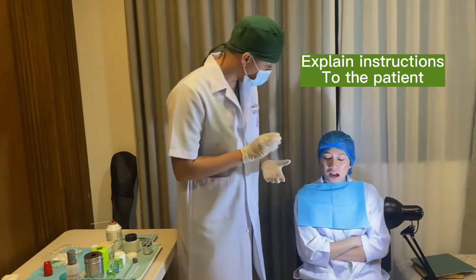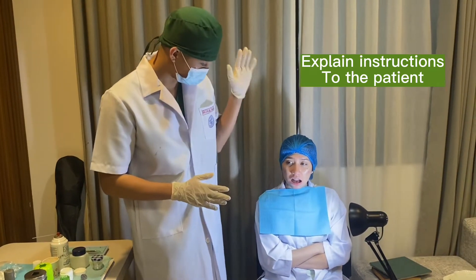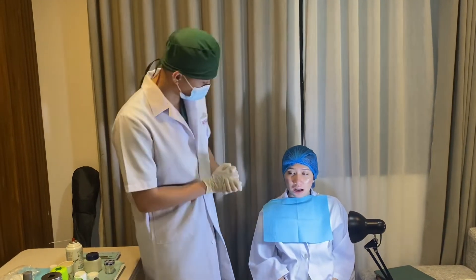I will now be putting something cold on your teeth. If you feel any pain, any sensitivity, anything at all, please raise your left hand — just like this. Can you practice it? Raise your hand. Okay, so I will now be doing it on your teeth.